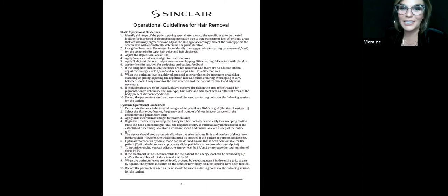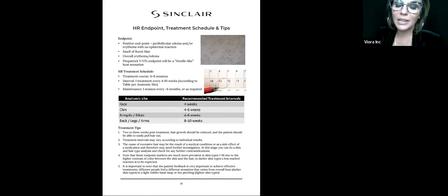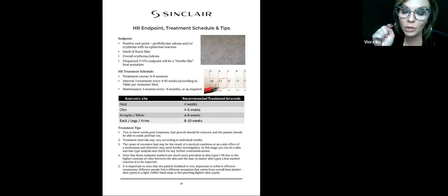Okay. What is our endpoint? Our endpoint is called perifollicular erythema and edema. What that means is that there's redness and swelling around each hair follicle. You can see it right there. There are little red dots. That's the perfect endpoint that you want. Sometimes you can't get that perfect endpoint on patients. So a secondary endpoint is going to be the smell of burnt hair.